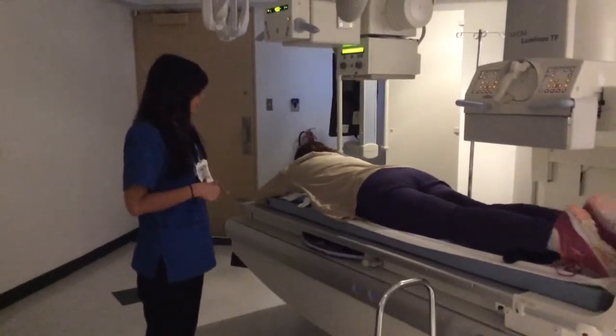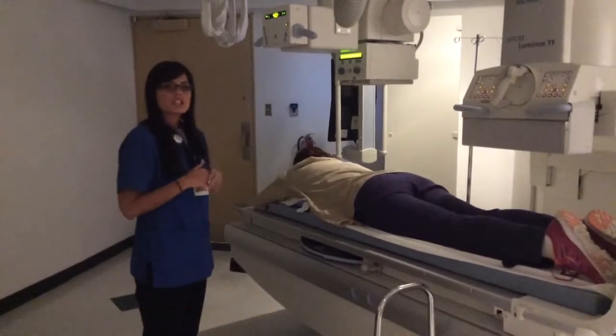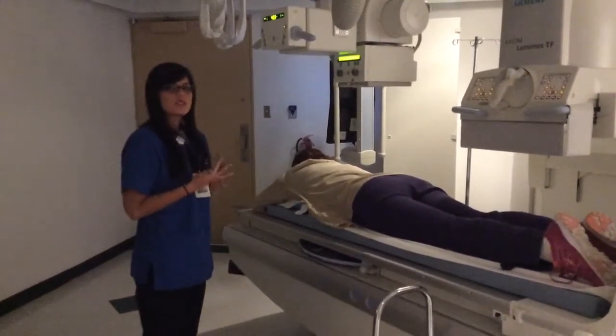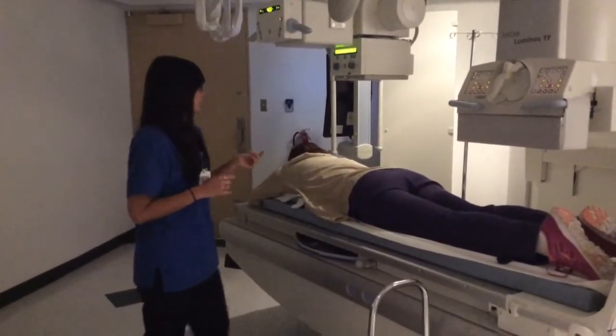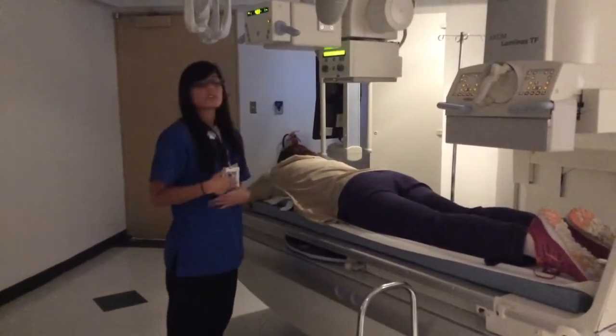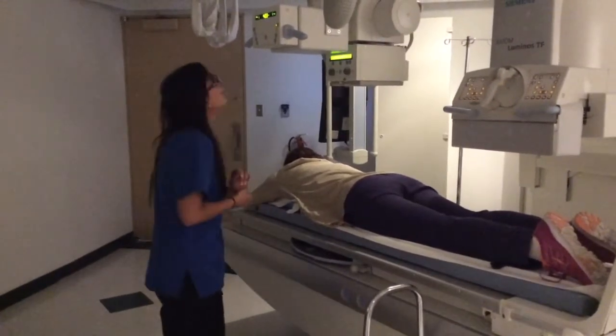After we do the first PA abdomen and the patient drinks the 2 cups, about every 30 minutes, 15 to 30 minutes depending on the department protocol, we would keep doing these projections until we see that barium has reached the large colon, the large intestine.